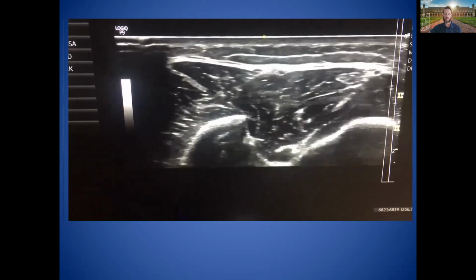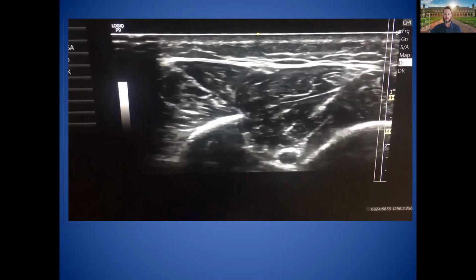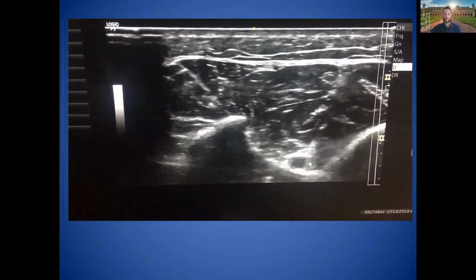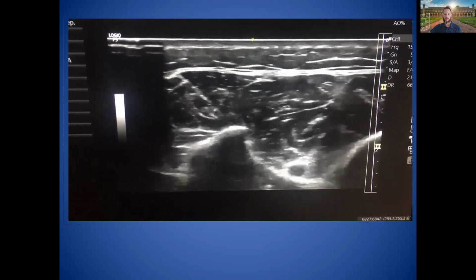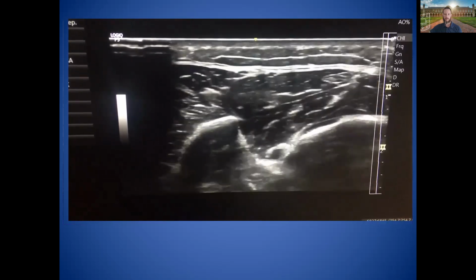As you move higher up the leg, it gets very hard to see. But because my son is only 18 years old, well, 17 actually, almost 18, it just fit. That's about as good as we can see it. Many people can't see it.